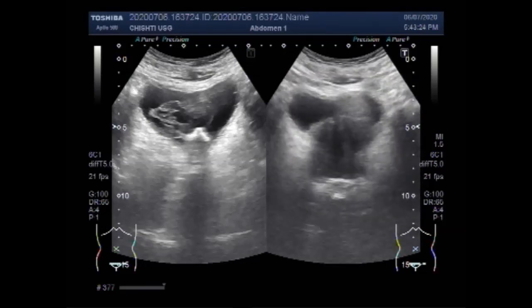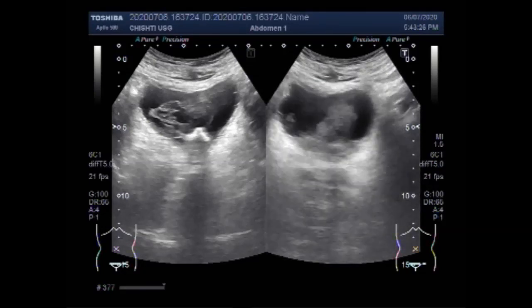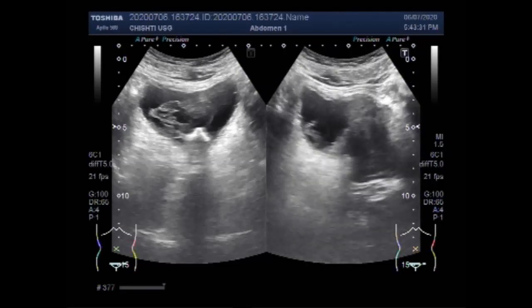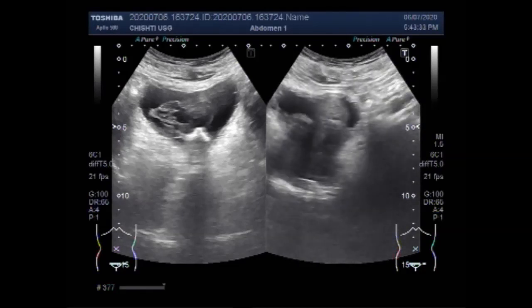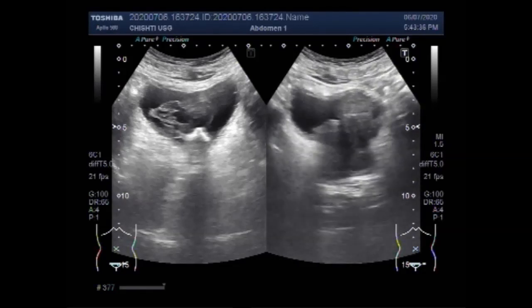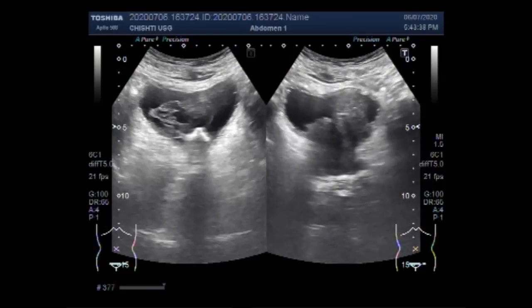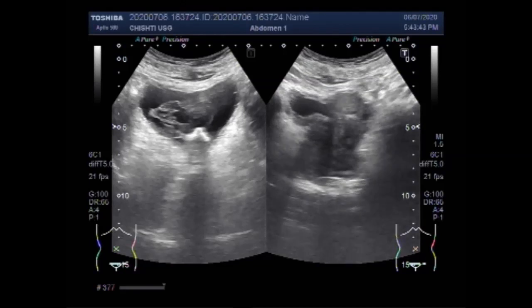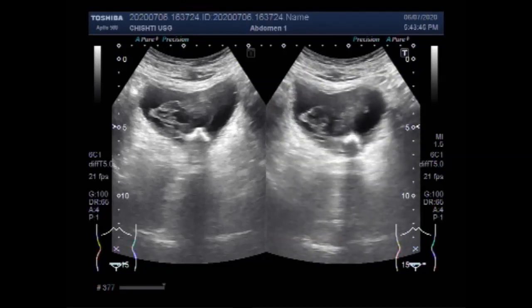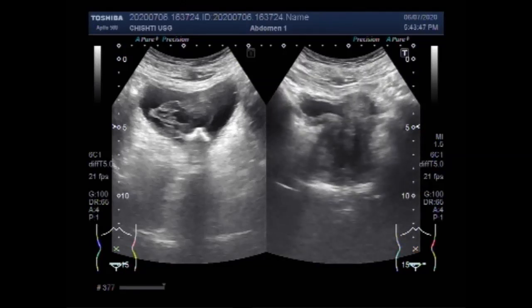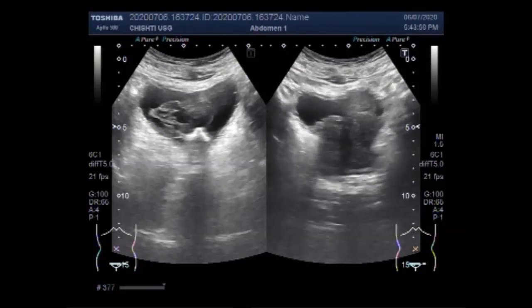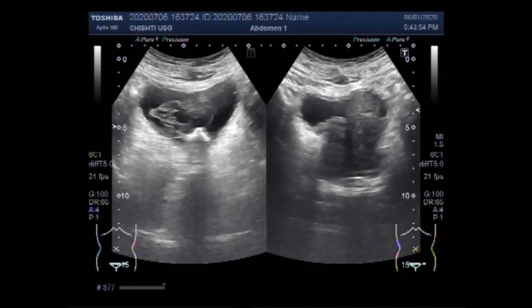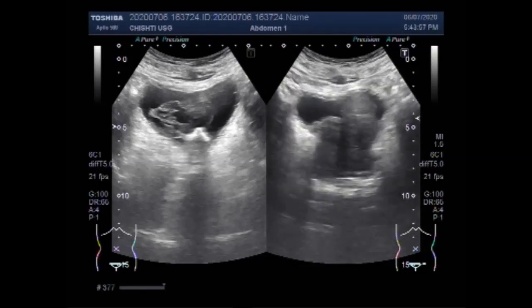Now you can see the benign prostate hypertrophy. Benign prostate hypertrophy, or benign prostate enlargement, is an extremely common condition in elderly men and is a major cause of bladder outflow obstruction in the aged patient. You can see the prostate is protruding into the urinary bladder.